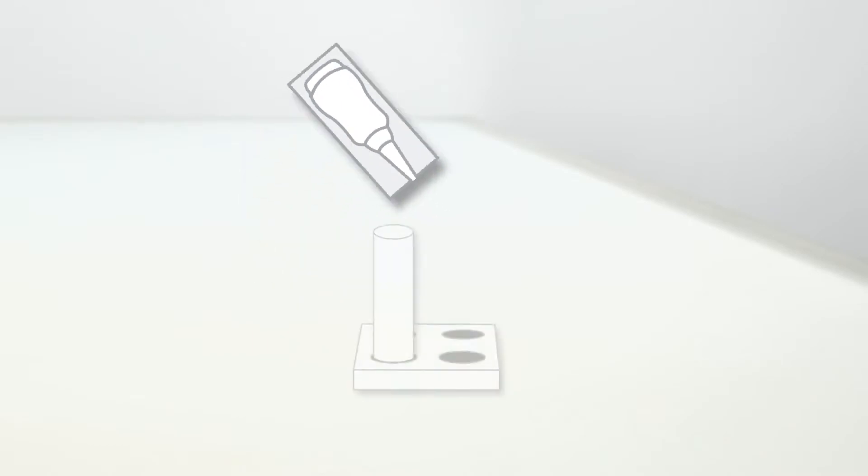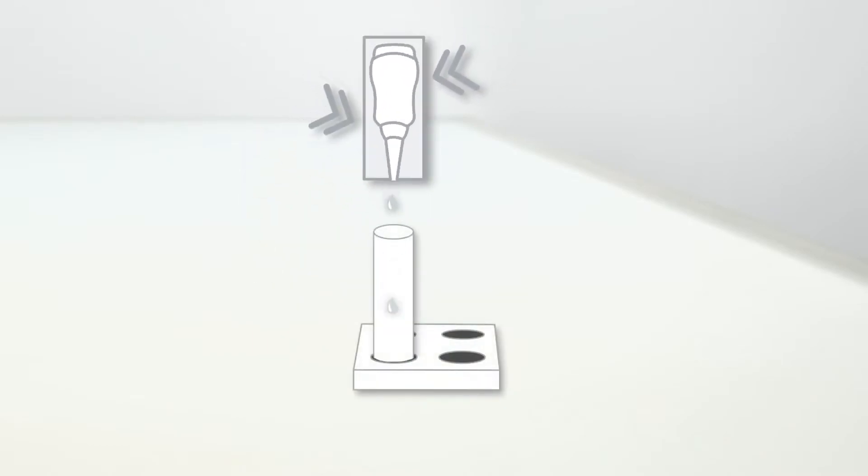Place a clean extraction tube into the reagent holder. Detach one buffer ampoule and open it by twisting the tip off. Make sure to hold the buffer ampoule vertically, squeeze it, and add the entire buffer solution to the extraction tube.